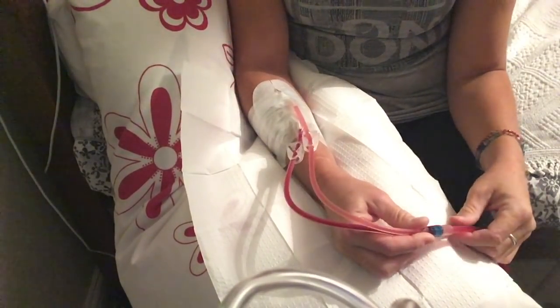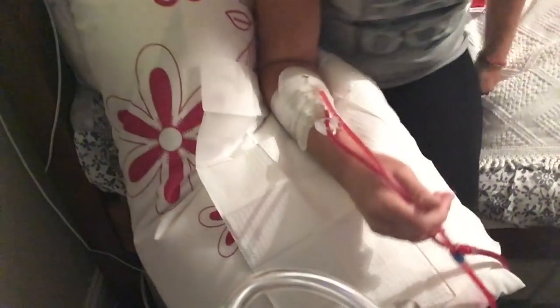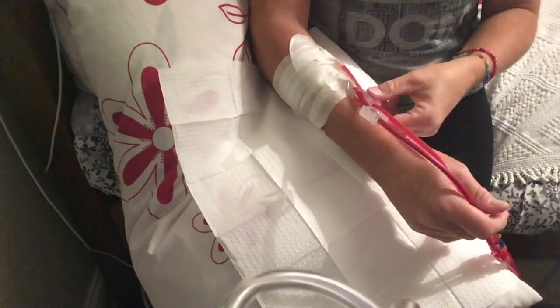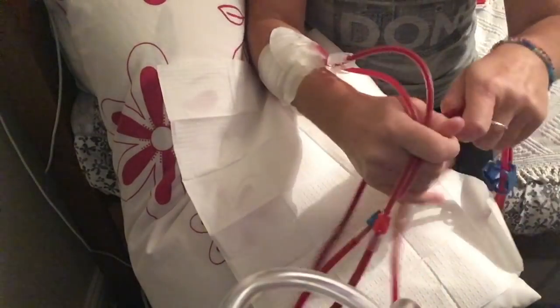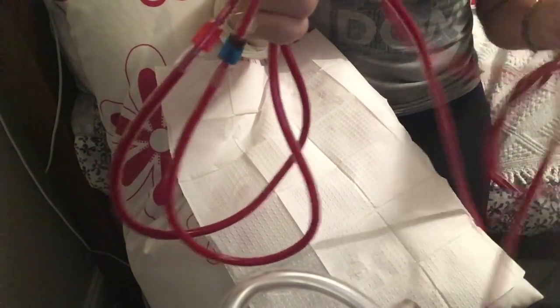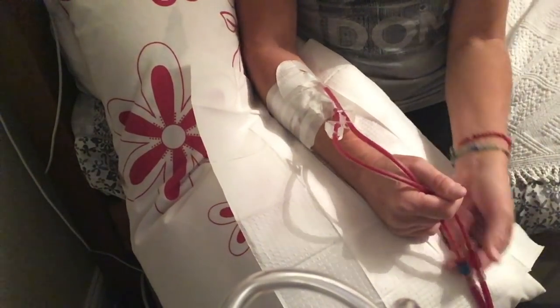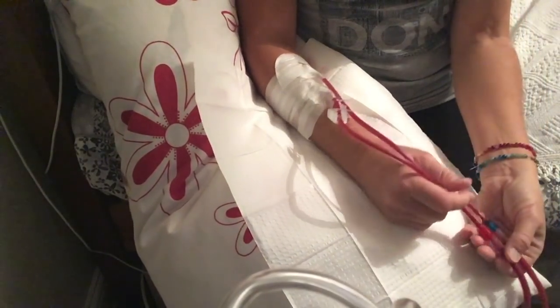Because I do six or seven hours usually as a treatment session, I run the blood pump a lot slower than you would on a normal four-hour session. I run it at about 180 mils per minute, whereas for a four-hour session you'd be looking at something like 300 or more. So it's much gentler on my fistula, and the pressures and flow rates are much lower. I have much more mobility in my arm and can sleep in pretty much any position.